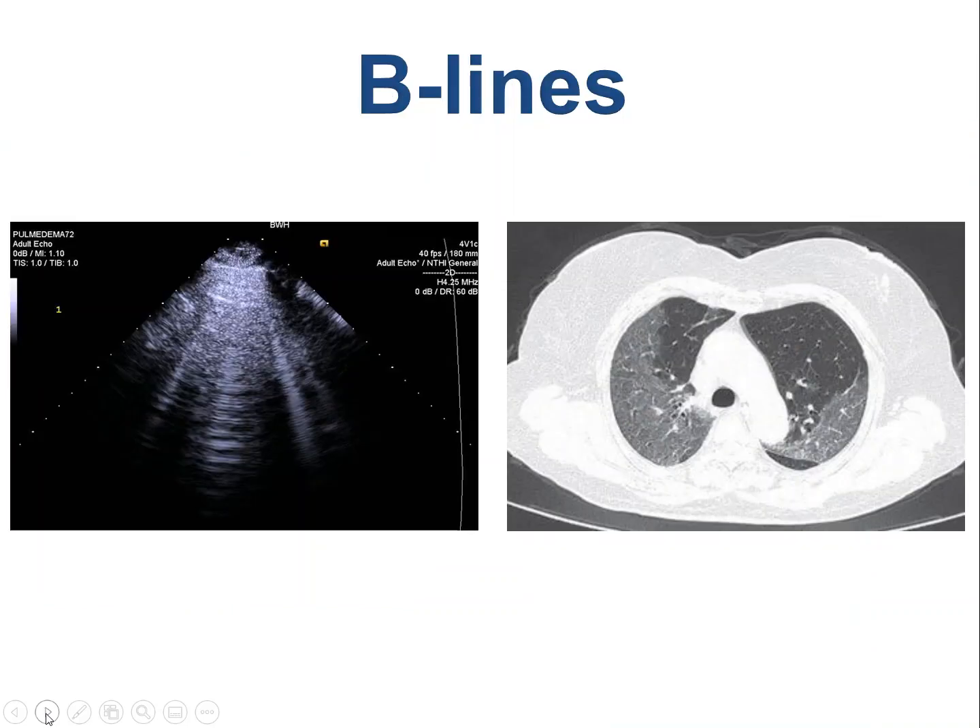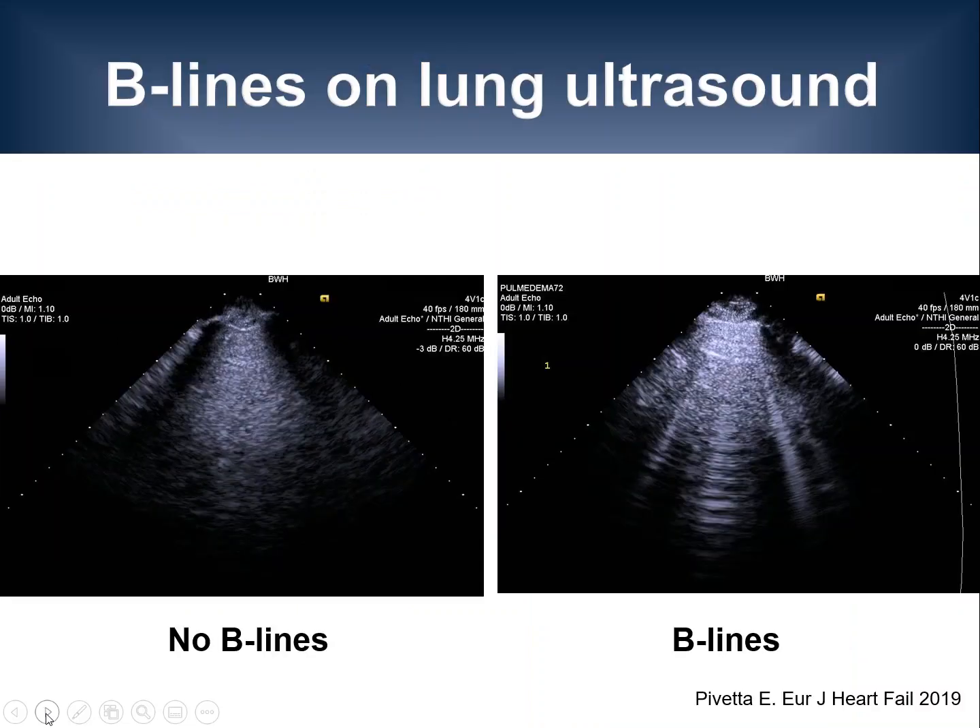So let's start by looking at B-lines. For the ultrasound exam, the transducer is placed in perpendicular orientation to the ribs in an intercostal space so that the ribs can be identified as landmarks. If you place the transducer on a healthy patient, you would see the image on the left-hand side — there are ribs up on top, the pleural line just underneath the ribs, and then deep to that, lung. What you don't see here are any artifacts that arise from the pleural line in the image on the left.